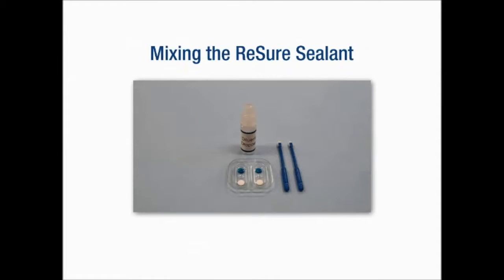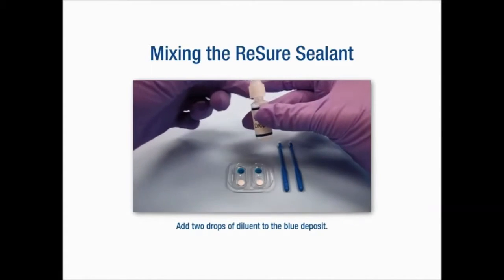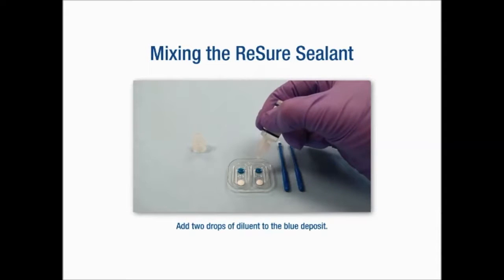In the event that you're not sure whether your wound is watertight, we are fortunate to have a product called Resure Sealant. It's a hydrogel sealant, very comfortable to the eye, made out of the same material that contact lenses are manufactured from.